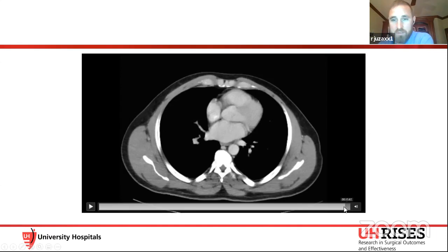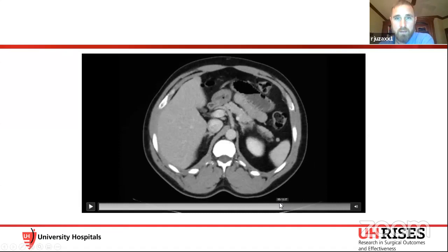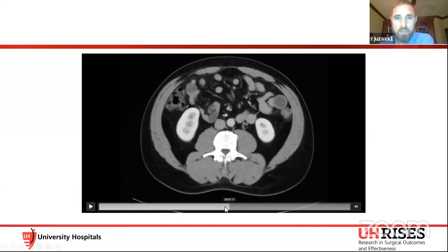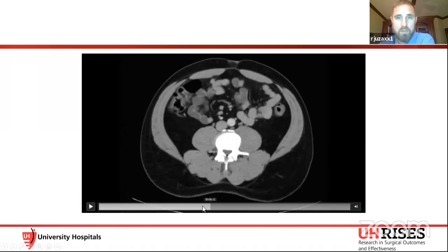First thing I'll do is focus from medial to lateral. I'll look at the linea alba. Linea alba looks intact, 1 to 2 centimeters, no diastasis, okay? All looks good. He's got a little umbilical defect there, fat containing, right?